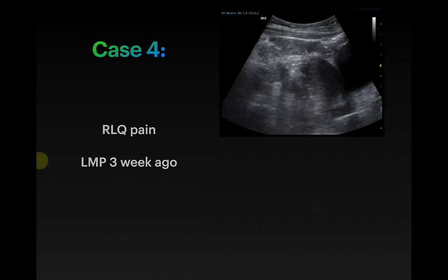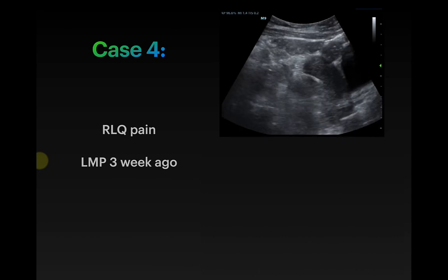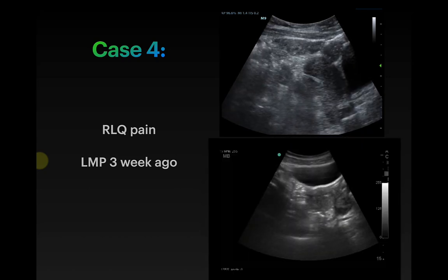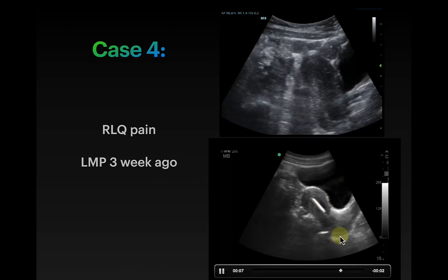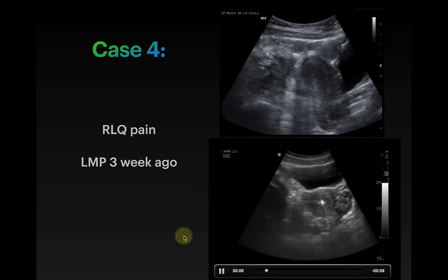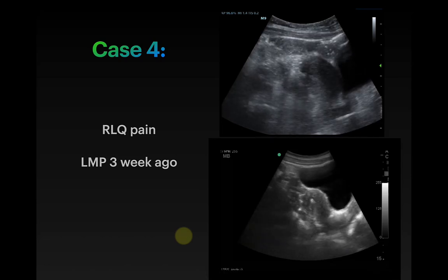All right, I think this is Dr. Gauger's case. I don't remember if there was a resident who did it as well, but he's the one who recorded the images and submitted them to us, which is excellent. What do you guys see here? So this is transabdominal. Here's the bladder right here. Here's the uterus. This patient has had abdominal pain off and on for weeks, but it started to get a lot worse in the last 2 days. What do you guys think? What do you see?